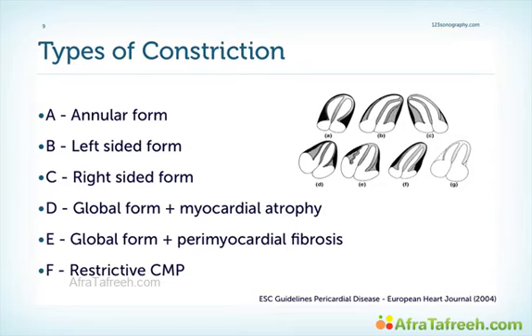There have been attempts to classify pericardial constriction based on where the thickening and calcification of the pericardium is. However, in reality and with echocardiography, this is very difficult to do. Usually we're happy if we can just make the diagnosis. But for surgeons, this certainly is an important point because if they want to treat constriction, they have to know where the thickening and where the calcification is. But they do that usually based on inspection. But for us, it's important to know that constriction can involve both ventricles or only one ventricle. It can also involve the pericardium around the atria, and it can also lead to atrophy of the myocardium.